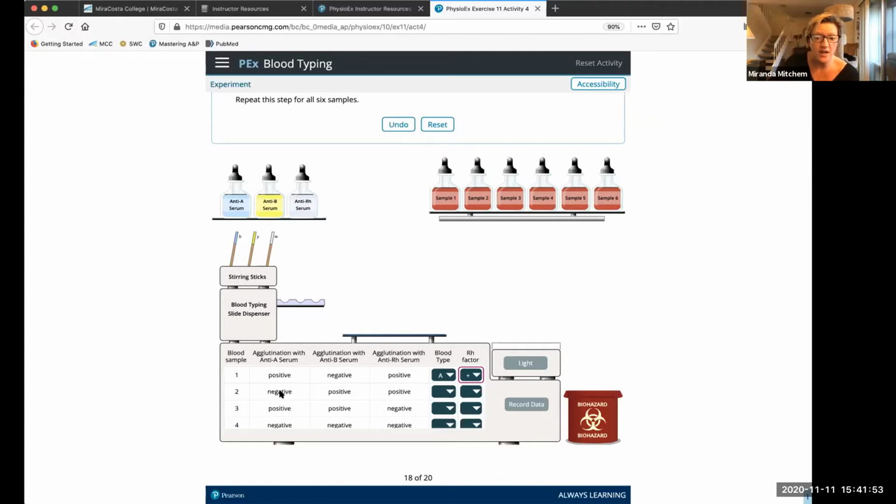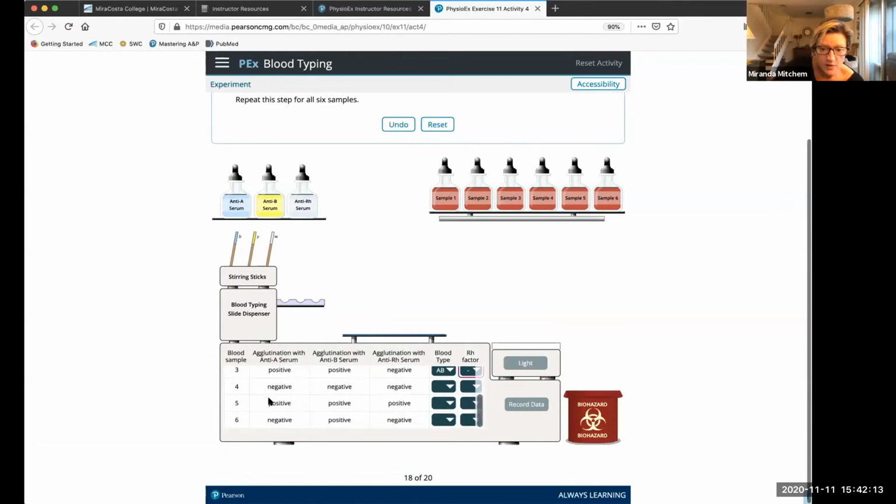So we're negative on A, we're positive on B, we're positive on RH. So this person is B positive. Now we've got positive, positive, negative. So they're AB negative. Oops, let me scroll down. Okay. And now we've got negative, negative, negative. Ooh, so they are O neg.